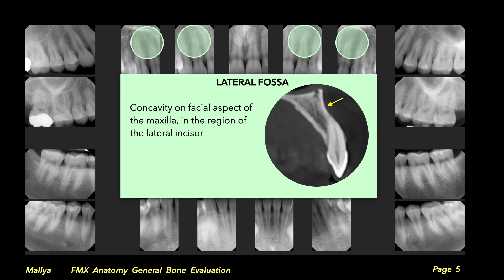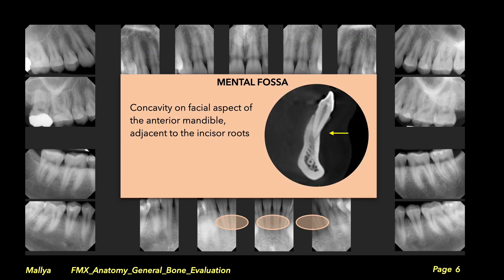Most importantly, you will note that the lamina dura surrounding the teeth is intact. This indicates that there is no apical periodontal inflammation. Thus, by ruling out disease, you establish normalcy of that radiolucent area.